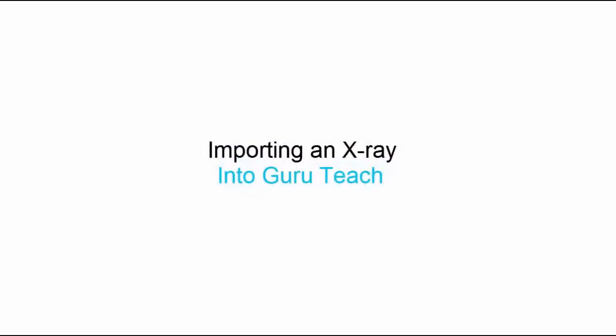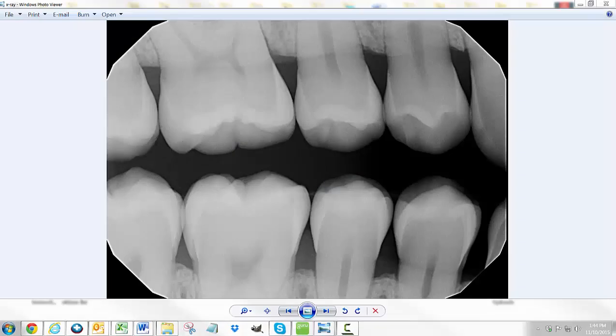Hello, my name is James with Guru Dental, and in this tutorial video I'm going to show you how you can get an x-ray image into the Guru Teach software if you are not a Dentrix Dexis user. Getting an image into the Guru Teach software is actually pretty easy. Keep in mind every imaging software is a little bit different, and what it will allow you to do is going to be different depending on which software you're using.